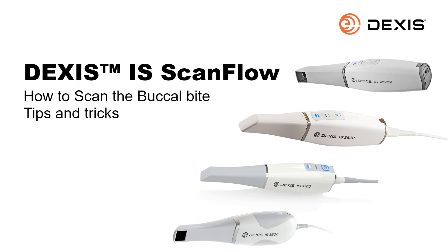Welcome to the DEXIS IS ScanFlow: How to Scan the Buccal Bite — Tips and Tricks Recorded Class. This recorded class is designed for clinical team members. It provides tips and tricks you can use to acquire a more efficient 3D model. By the end of this session, you should be able to efficiently scan the buccal bite.